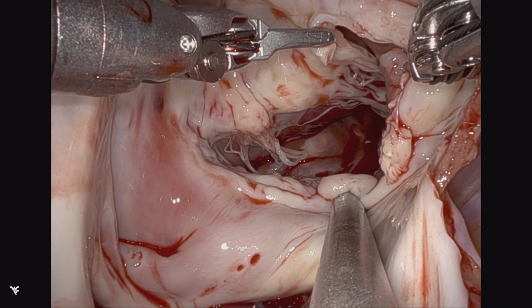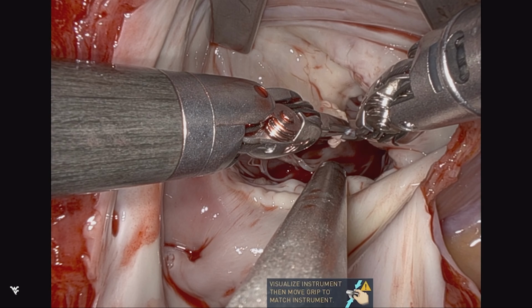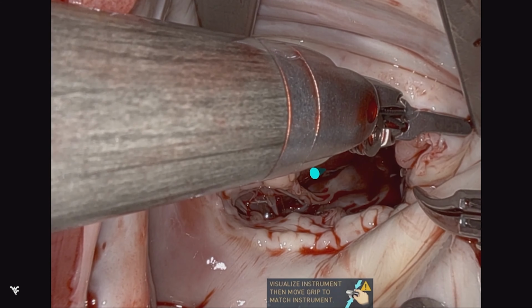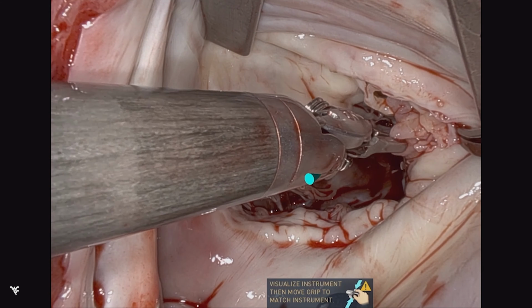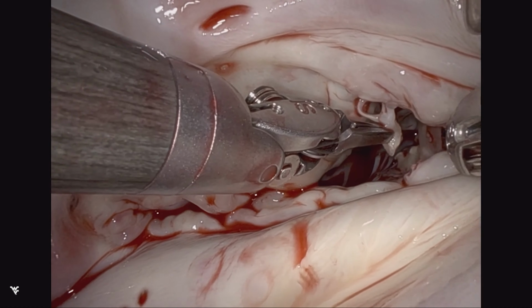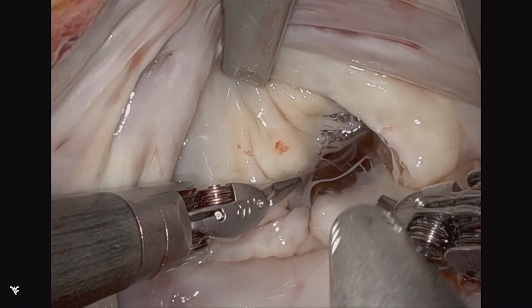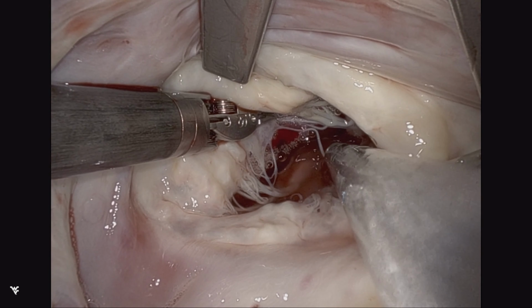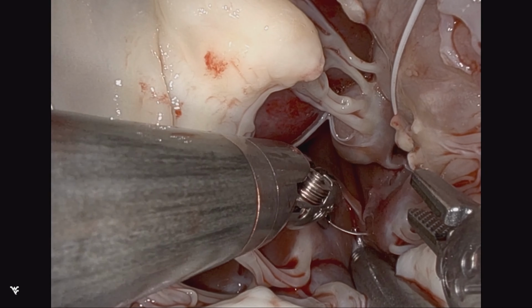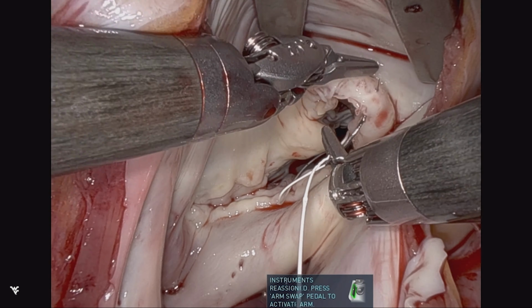Upon exposure and evaluation, one can appreciate the healed vegetation, which is resected, and the substantial amount of unsupported tissue. So you can see this involves the commissure and the majority of the beginning of P3. Now there's no active infection anywhere, and so in this situation, we elected to support this leaflet with neocords.